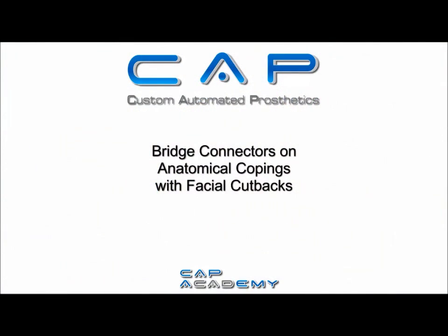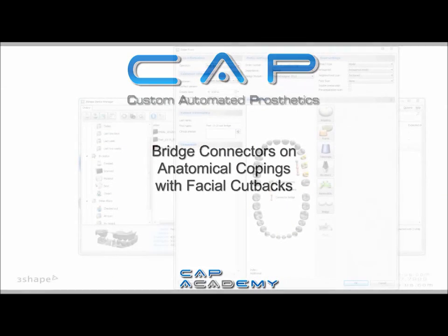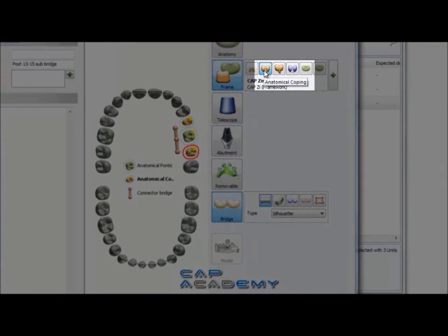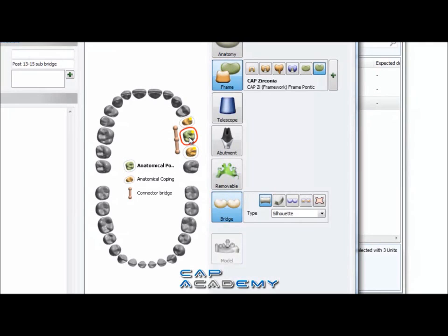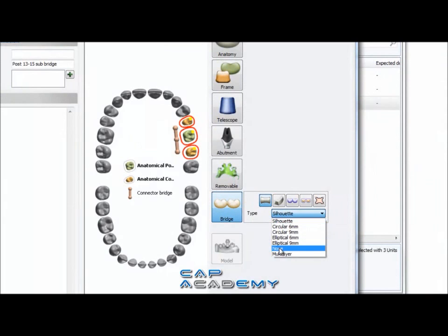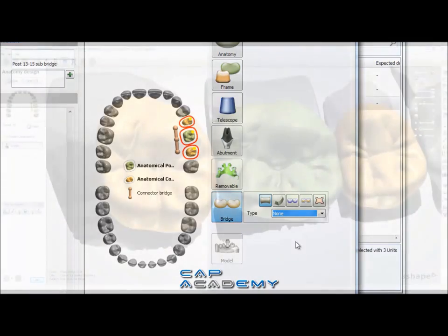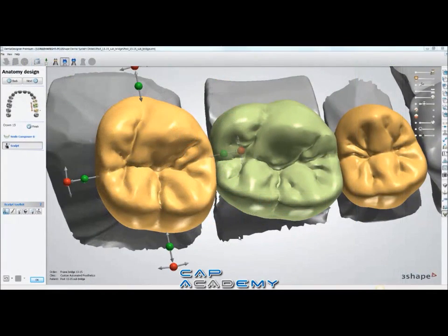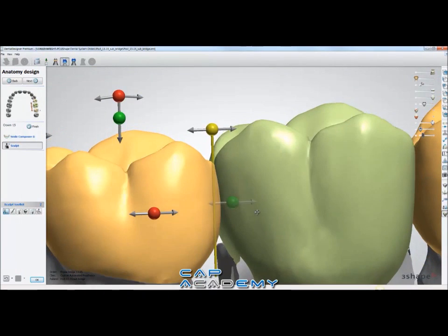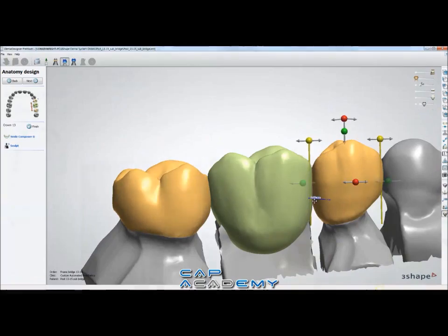Next I'm going to go over bridge connectors on anatomical copings with facial cutbacks. This also works with interproximal struts. So I'm just setting up the case — it's an anatomical coping and an anatomical pontic. Select all three, and you notice it defaults with Silhouette. I'm going to bring this down and just do none. If you go through this with Silhouette it's not the end of the world — you can change individual bridge connectors during design. With anatomical, you do a full contour design the same exact way as a full contour bridge connection.